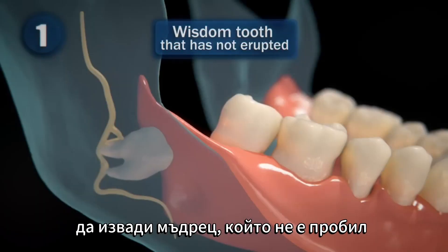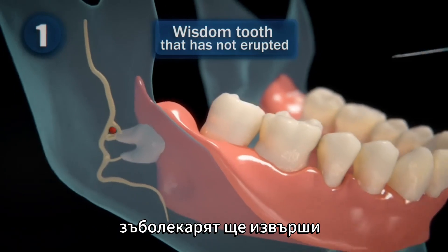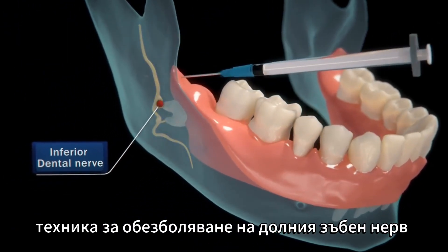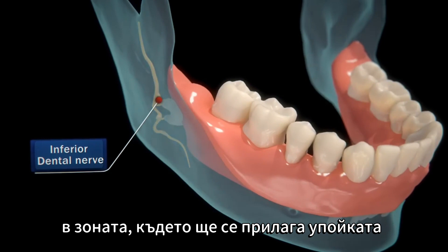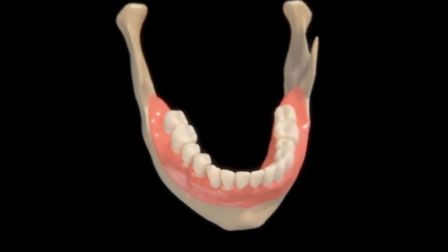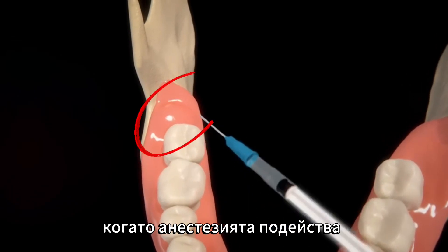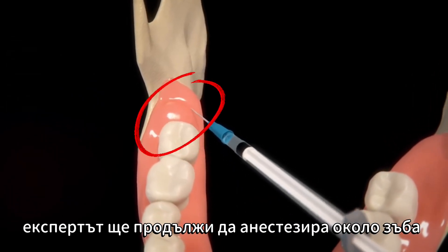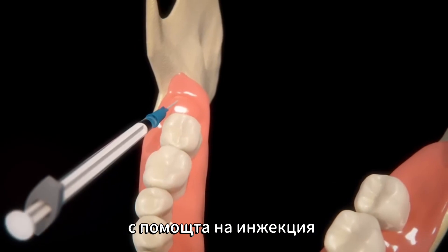To extract the wisdom tooth that is not erupted, the dentist will perform a nerve block technique to the inferior dental nerve in the area where the anesthetic will be applied. After one minute, when it has taken effect, the expert will proceed to anesthetize around the tooth with the help of an injection.